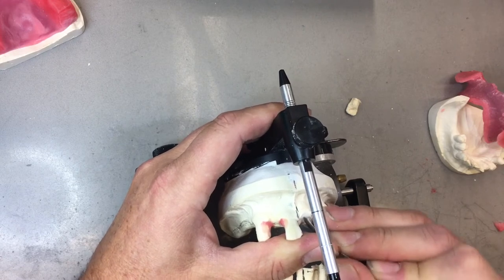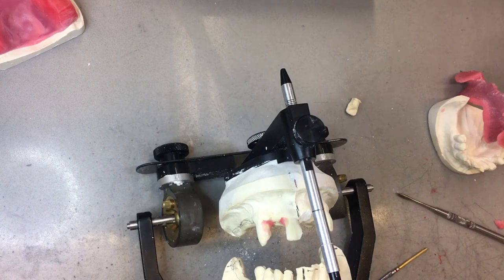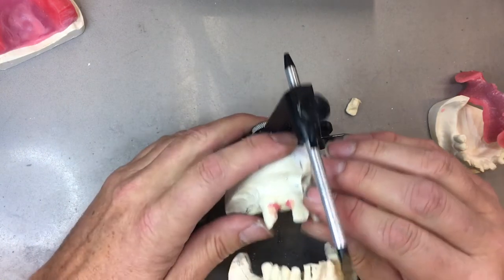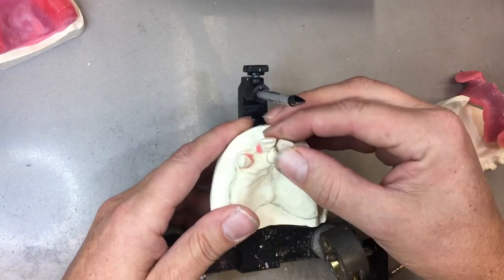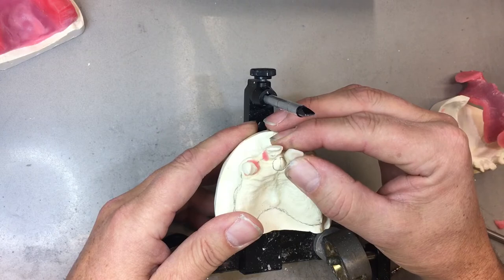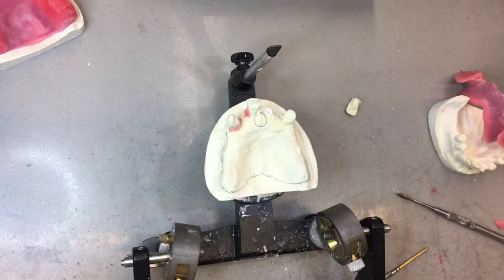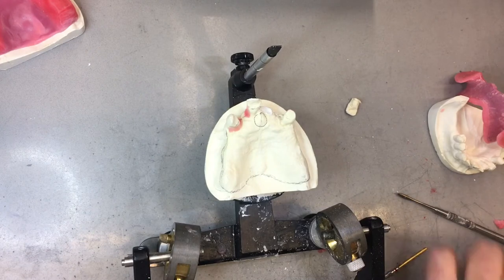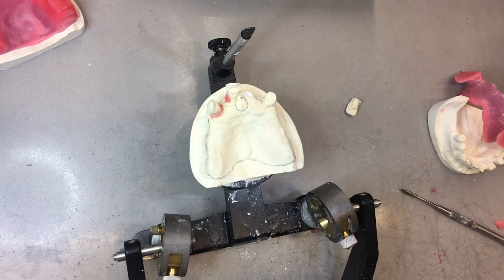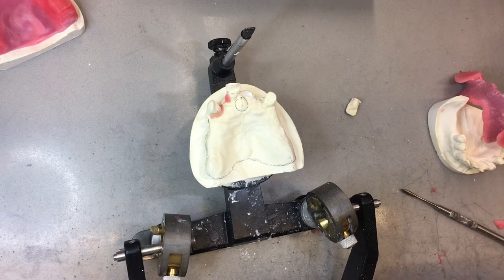I'm going to start with one at a time here — this central — so I have the other central in relationship to see how much overjet I'm reducing. If I take both centrals off, I don't know where I was. If I had the occlusion rims on this model, I could use that to set up on, but I'm just going to go straight to finish.